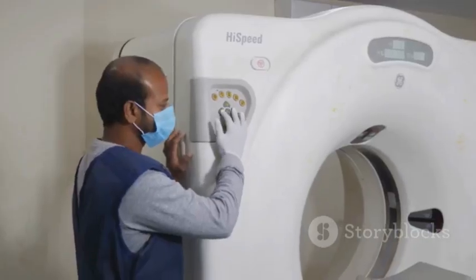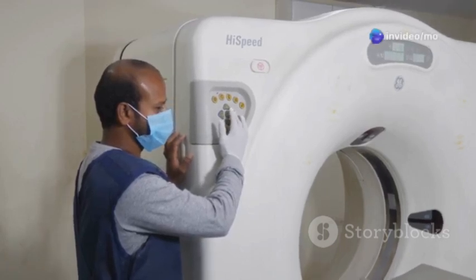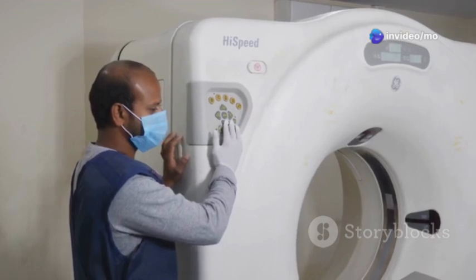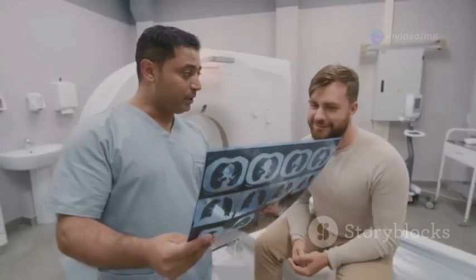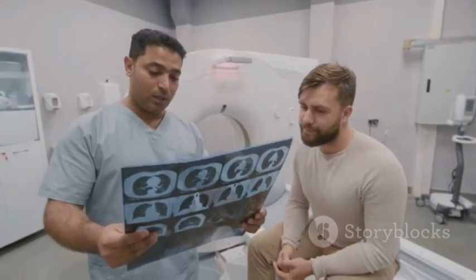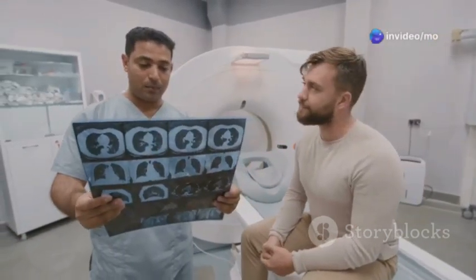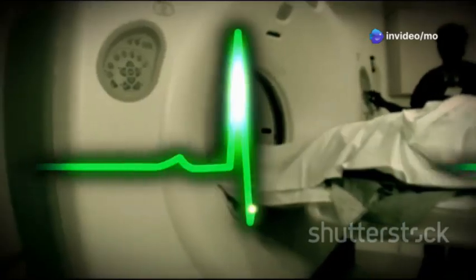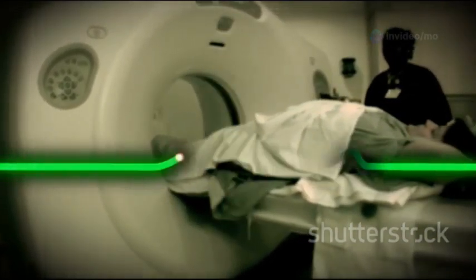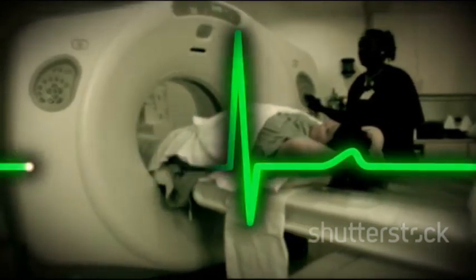Unlike conventional CT scanners, which measure the total amount of X-ray energy absorbed, photon-counting CT scanners can detect and count individual X-ray photons. This ability to measure X-ray energy levels directly provides richer information about the composition of tissues and allows for more accurate material differentiation. Photon-counting CT has the potential to revolutionize various aspects of medical imaging, from cancer detection to cardiovascular disease assessment.